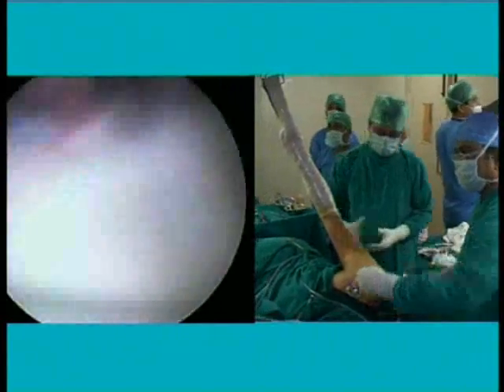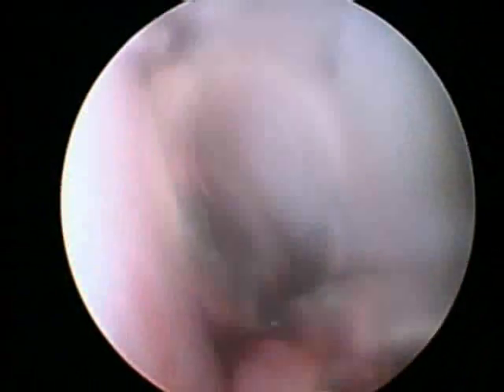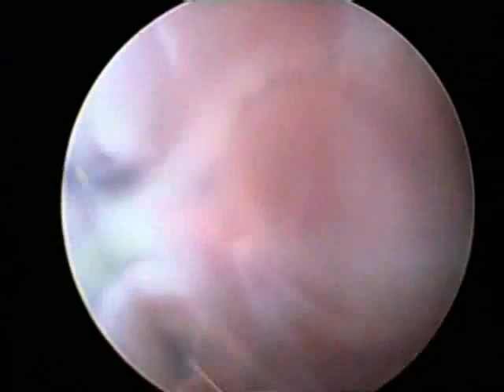Right. So what I have done is I have gone through his joint. He has a very small Hill-Sachs. I have run into a little water problem. Can somebody puncture that bottle, please? Audience, if you want to ask any questions, please feel free to interrupt. This is a small Hill-Sachs.